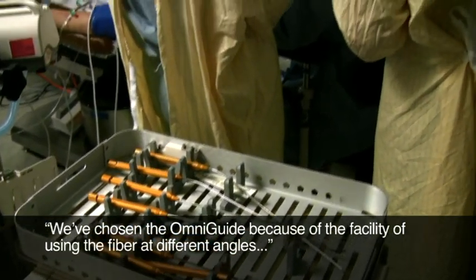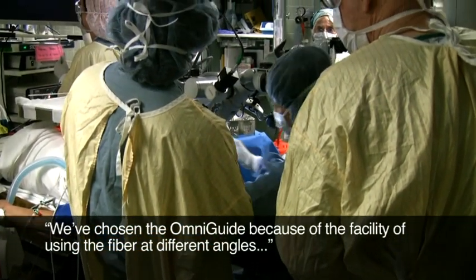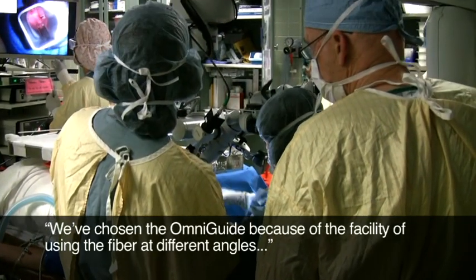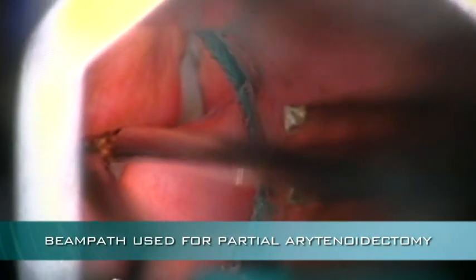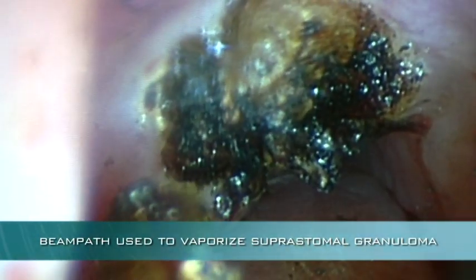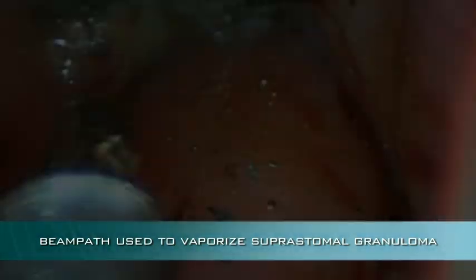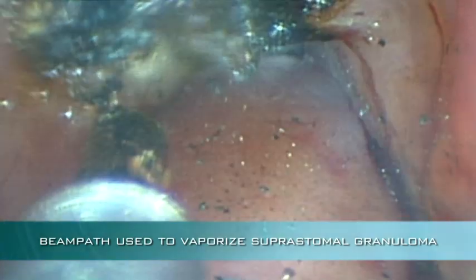So we've chosen the OmniGuide because of the facility of using the fiber at different angles and again because of the line-of-sight issue. Together with Dr. Shapshay, I was able to do a partial arytenoidectomy today to open up the posterior part of the glottis, took out a little bit of the vocal process and the left vocal cord, and then we lasered the suprastomal granuloma in order to alleviate that obstruction, which would have been another problem or would have gotten in the way of us decannulating her.